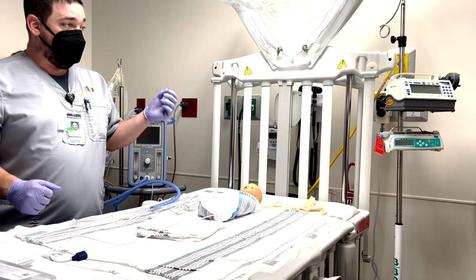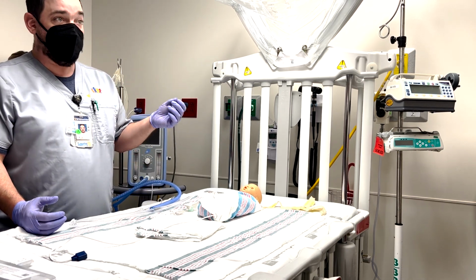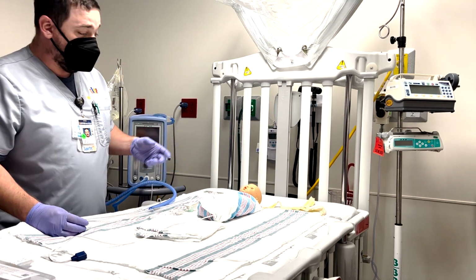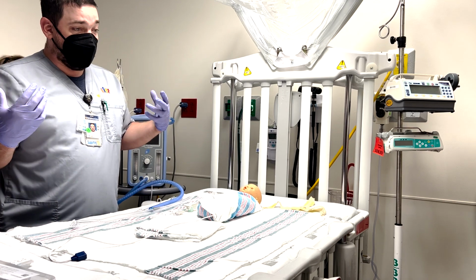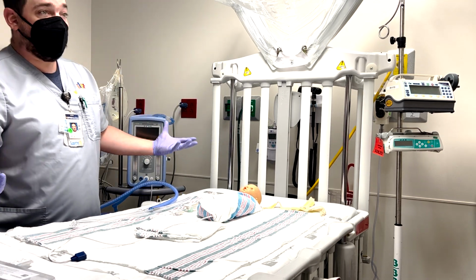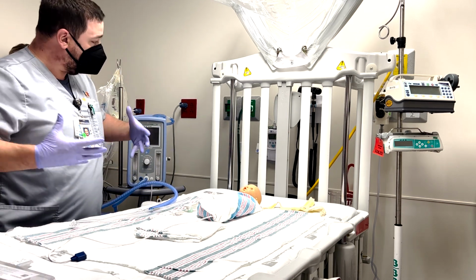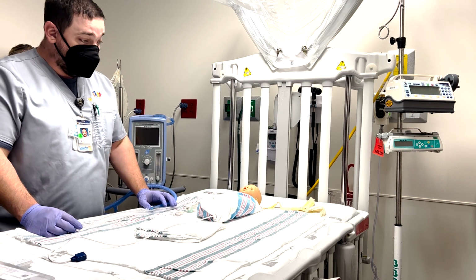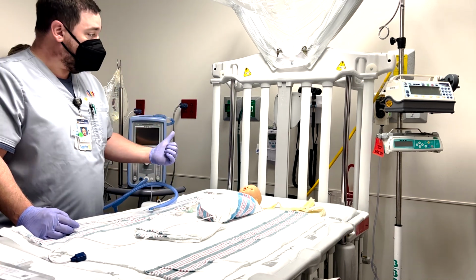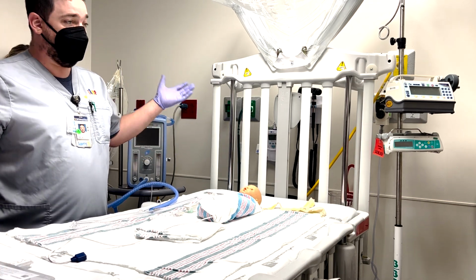When it comes to high flow, you have air entrainment. The cannula does not occlude the nose completely, correct? So when you do occlude the nose completely, that flow, as it goes into the patient, overcomes resistance, creates a pressure. That's your PEEP. Okay, positive end expiratory pressure keeps the lungs from collapsing. A higher amount is required to help the patient breathe, eliminate work of breathing, cause them to become less tachypneic, hopefully increase saturations. Again, better gas exchange. That is our overall goal here.